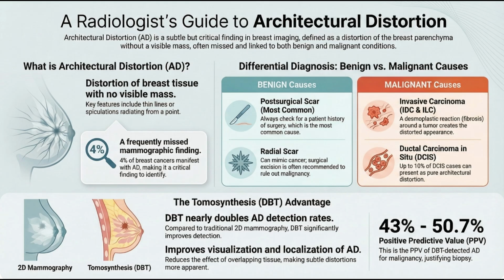That's the crucial issue of radiology-pathology concordance. If your imaging is highly suspicious but the pathology comes back benign, you have a discordance. You cannot trust that result. Further evaluation is mandatory. That usually means a repeat, more targeted biopsy or, more often, surgical excision. The concern is always that the first biopsy missed the small focus of cancer. So a false negative. A false negative from sampling error.